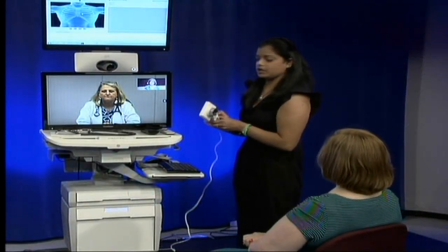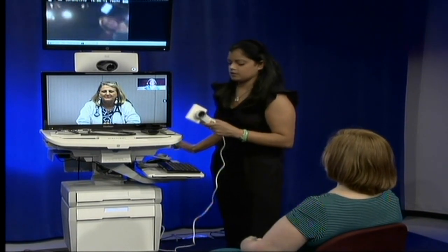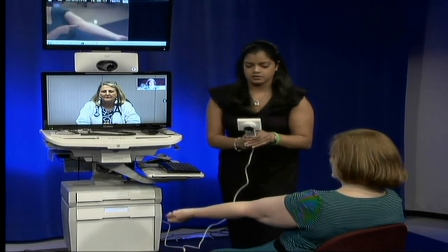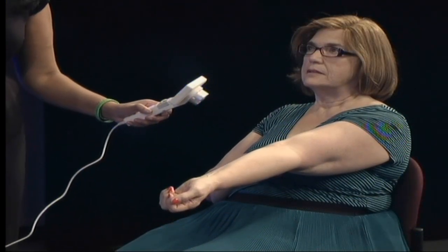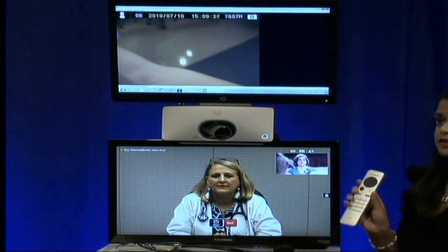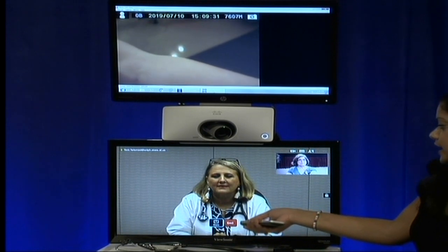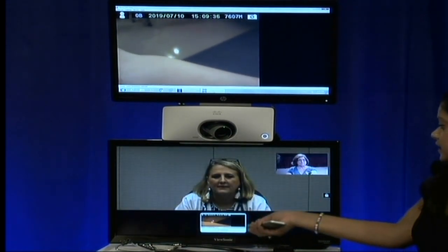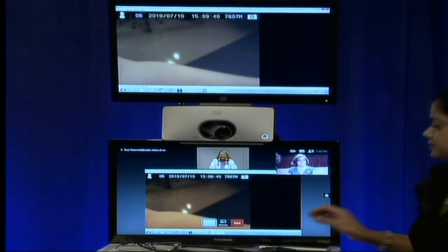Okay, we have our camera on and our application open. We will now direct the camera towards the spot. And we will share what we're seeing with Dr. Wilson by taking the silver remote and pressing the share icon that's selected. Pressing it again, and now it's shared with the provider.